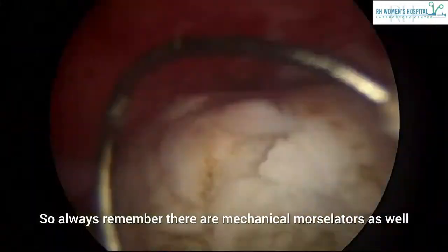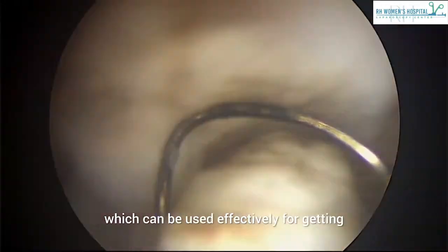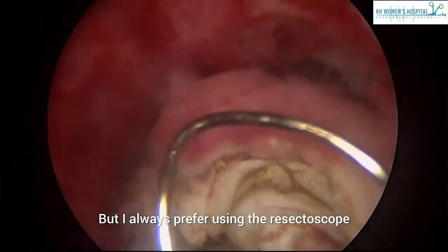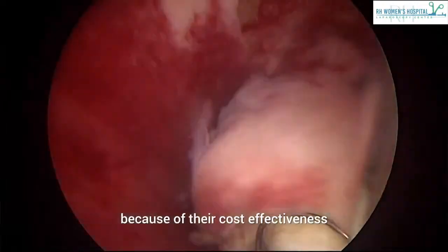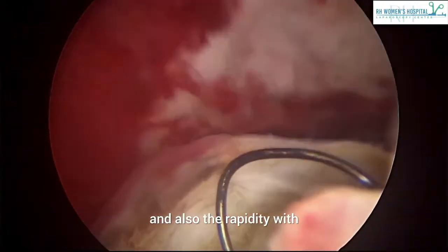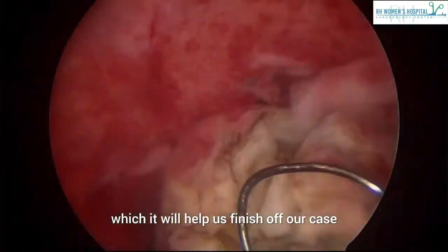So always remember, there are mechanical morcellators as well, which can be used effectively for getting rid of these fibroids, but I always prefer using the resectoscope because of its cost effectiveness and also the rapidity with which it will help us finish off our case.